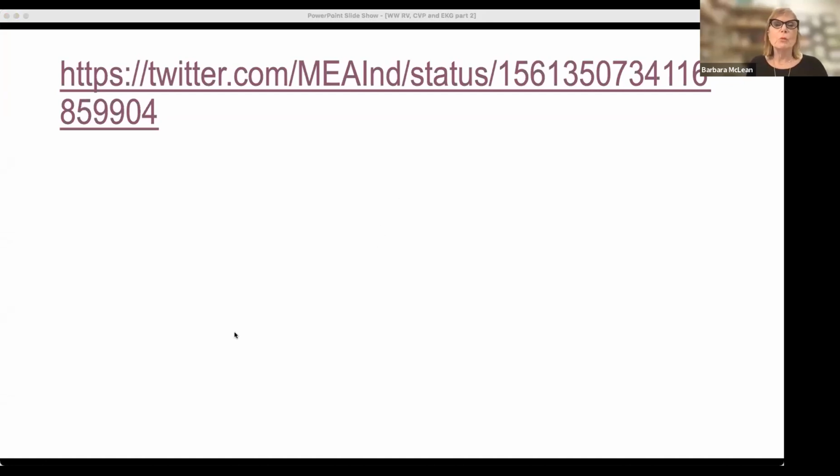Wanted to show you tricuspid regurgitation because I did not have a great waveform. This is from someone's Twitter account, but it's like the most gorgeous thing I've ever seen in terms of talking about severe tricuspid regurgitation. So looking at the patient's neck veins, you can see A wave, V wave, A wave, V wave. The little bump down here at the bottom is the A wave, and the big bump here is the V wave. And when we look at his CVP, his C wave and his V wave are merged together with a really big upright, right?